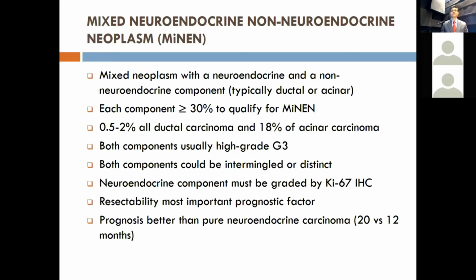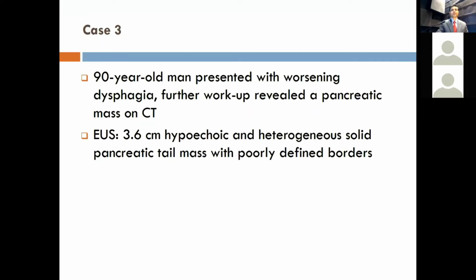Another thing I would like to mention on this is that immunohistochemistry is essential in diagnosis of these tumors. As you can see, the morphology can be very mixed. It is by application of immunohistochemical stains that you will get the right diagnosis.